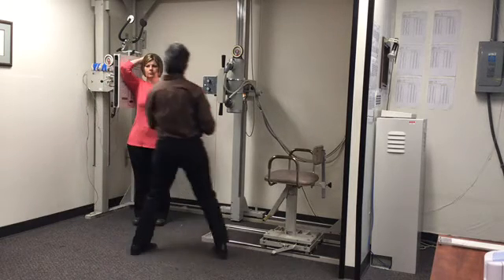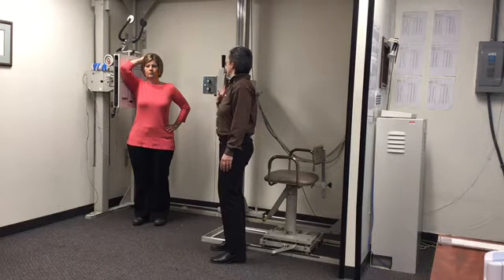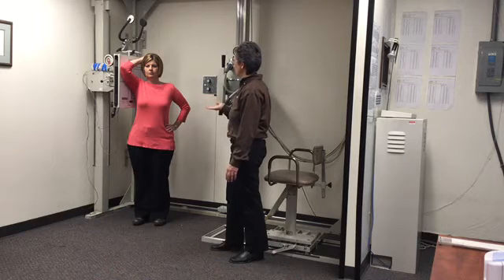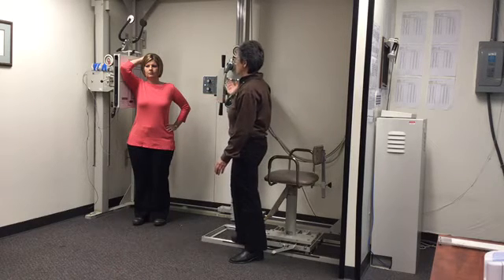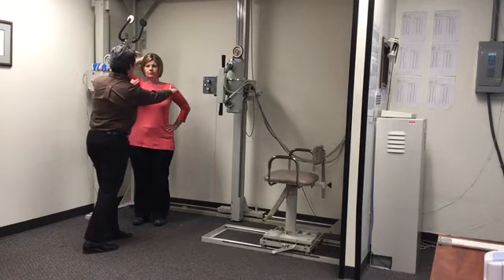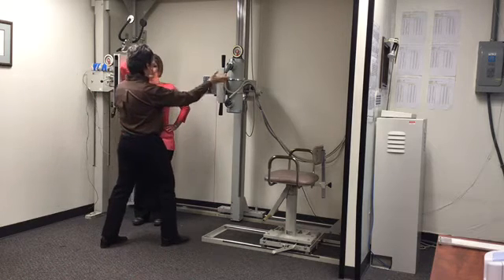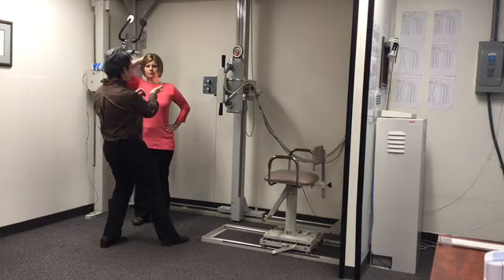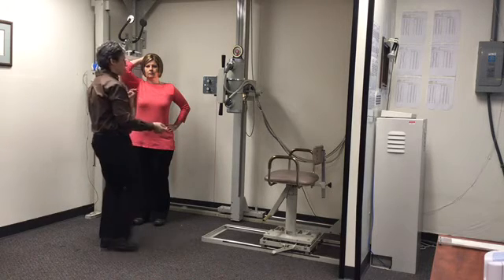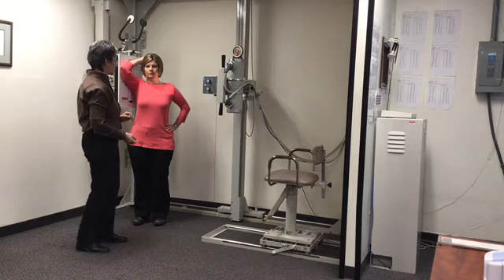Okay. And collimation is still into a 10 by 12 field. There is no tube angle, so it's still coming in 90 degrees to the patient. If we thought we couldn't get enough separation between the humeral heads, you can tilt your tube at 5 degrees caudal, and that will create more separation between the humeral heads. It's not a requirement for this image, but it's an option that national boards might ask you about.